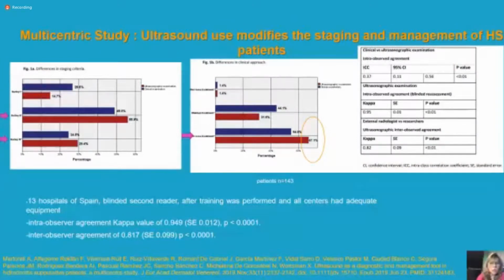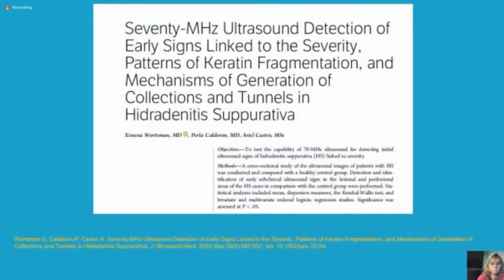We know that the intra-observer and inter-observer agreement using ultrasound in hidradenitis suppurativa is much better than the intra and inter-observer agreement of the clinical scorings. And this was proved in this multicentric study that was performed in 13 hospitals of Spain.